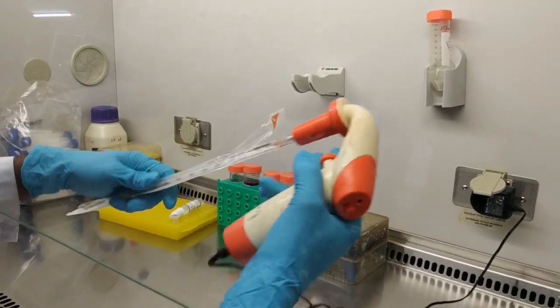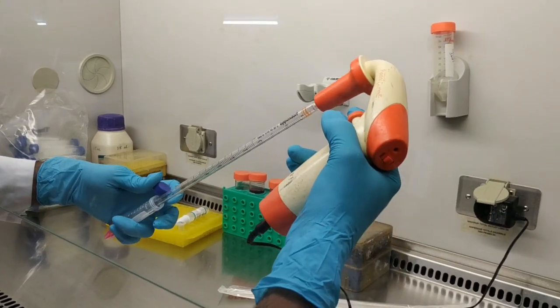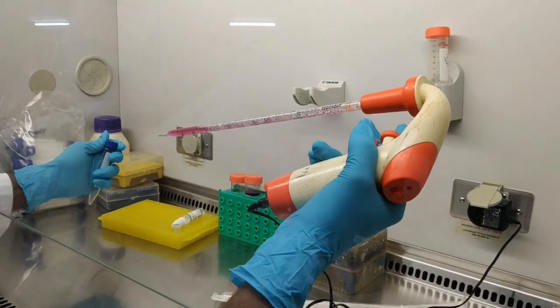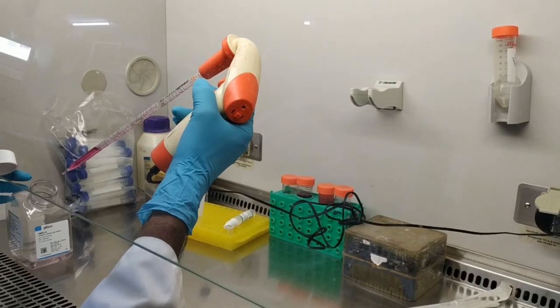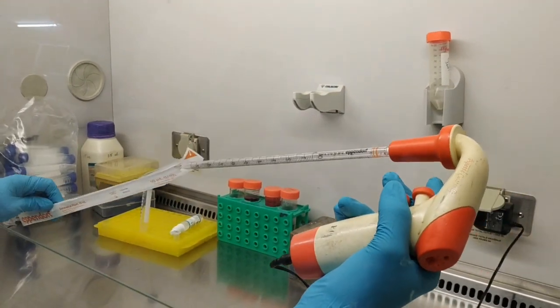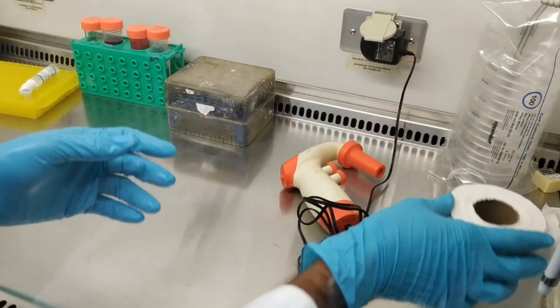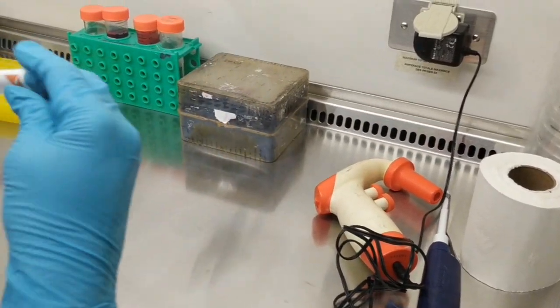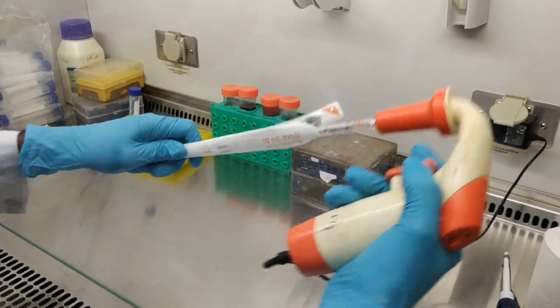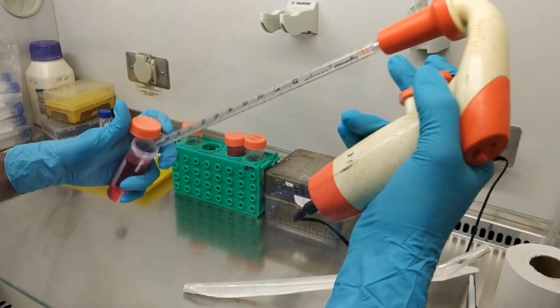without disturbing the pellet that contains the cells. Without disturbing the pellet, you can discard the supernatant completely. You can remove it, and to the pellet you can add the fresh medium. Based on your experiments, you can add into different culture vessels and also different kinds of flasks. So completely resuspend the cells with the medium.